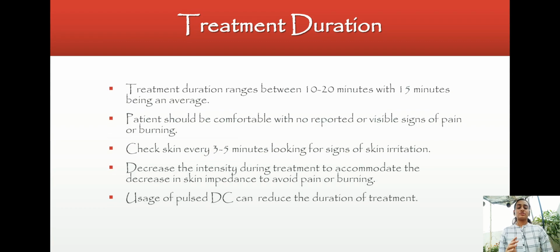The treatment duration. The treatment duration ranges between 10 to 20 minutes, 15 minutes being an average, and the patient should be comfortable with no reported or visible signs of pain or burning. Check the skin every 3 to 5 minutes looking for skin irritation, and decrease the intensity during the treatment to accommodate the decrease in skin impedance to avoid pain or burning.